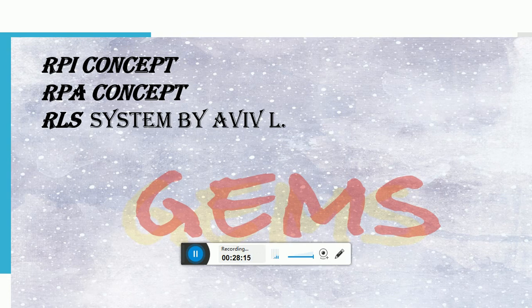And yes, after RPI, RPA, and RLS system, you should know something about the circumferential clasp and bar clasp difference. Basically, I will tell you only one important point, that is the retention. In circumferential clasp, you have the retention that is pull type, and in bar clasp, you have the retention called push type. Very, very important MCQ.